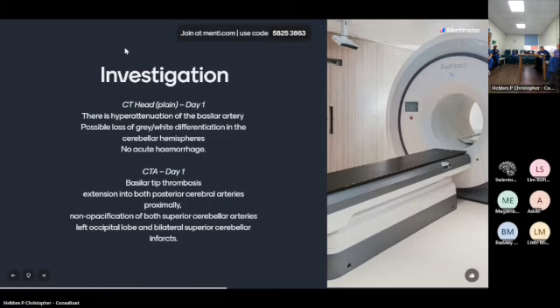What might that mean? Ischemic stroke, actually. So hyperattenuation, that might be something like a clot sitting there. And what does loss of grey-white differentiation mean to us? Or what could it mean? Sort of hypoxic insult that occurs not immediately, as in some time has passed. You wouldn't necessarily see that initially on a scan. We sometimes see changes initially. That's usually a fairly bad sign, although all of the guidance that we'll come to later generally highlights that it's probably a fairly bad thing to prognosticate based on the early scan. But you would worry about hypoxic insult. You might worry about some edema as well.